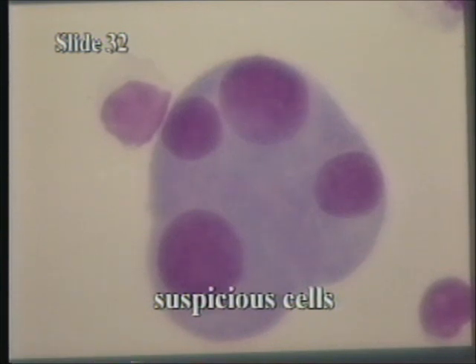They look somewhat uniform, but we can't really see individual cell borders, and the chromatin pattern doesn't look quite right. We think these are suspicious, and whenever the cells look suspicious, you get to pass it off on the pathologist.